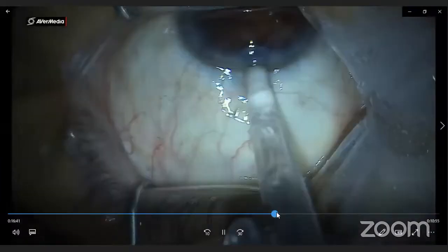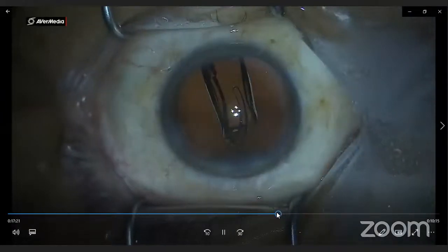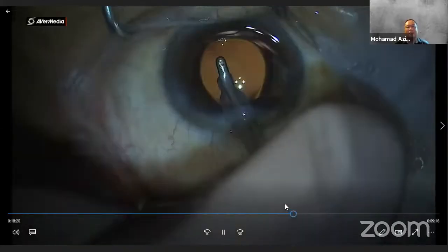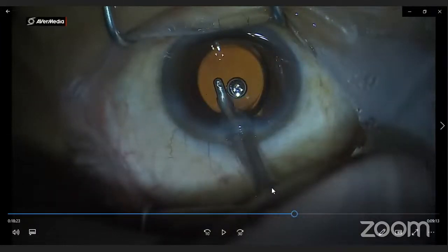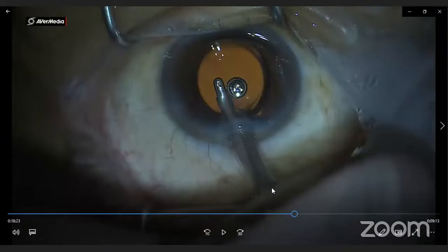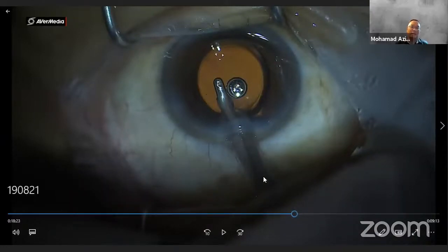Sorry. Then the lens insertion part. Tak keluar parameters ni. Yes, betul. Tak keluar parameters kan? The Signature Pro on OT2 tu tak keluar parameter. This is Signature Pro, betul. Kalau Stellaris tu baru dia keluar. We don't have overlay, dia ada. Yes, betul.